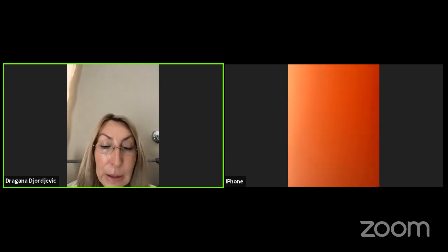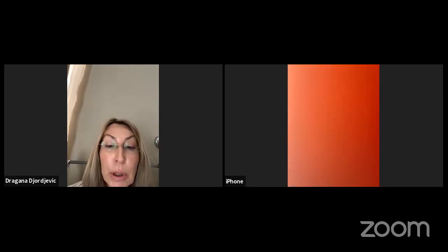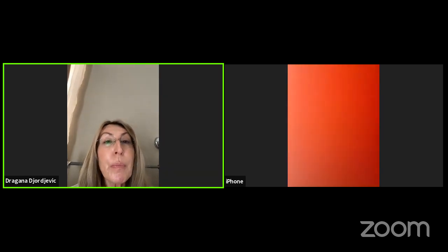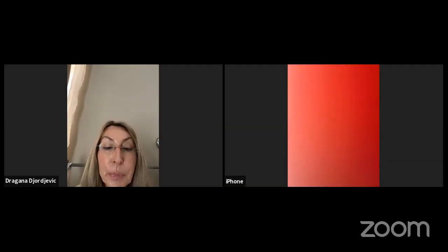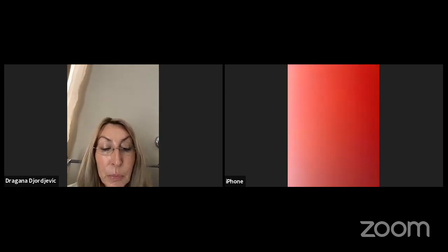Professor Isaacson had a comment. Keith, did you want to say something? No, I was just writing. His comment was that the 1 chip is fine with the small monitor. Yeah, please give us a comment. I was just saying that I agree that the cost effectiveness of having the 1 chip on the small monitors is worth it, and that you don't need the 3 chip for the small monitors that you typically use, at least for office hysteroscopy. So that was my only comment. Thank you.